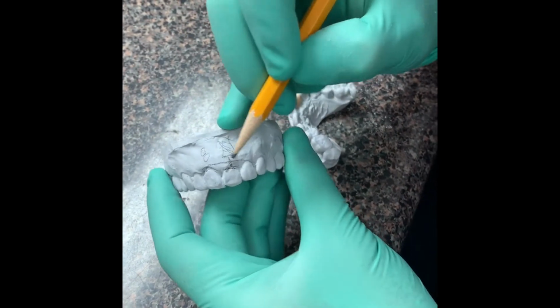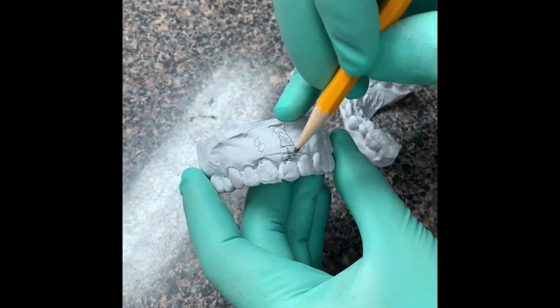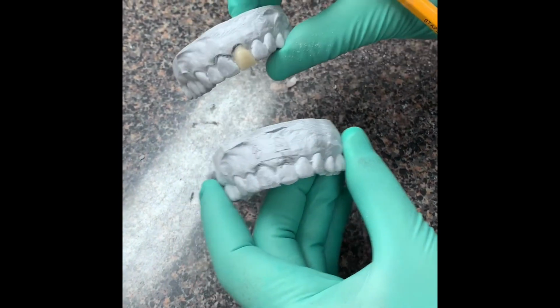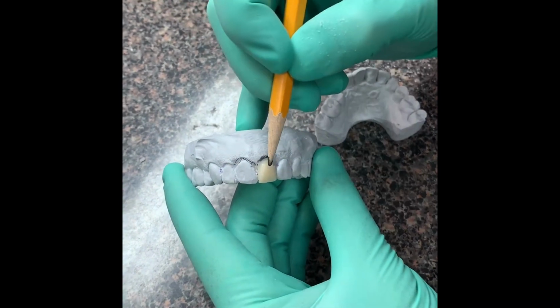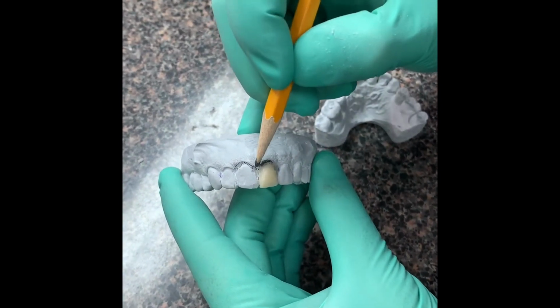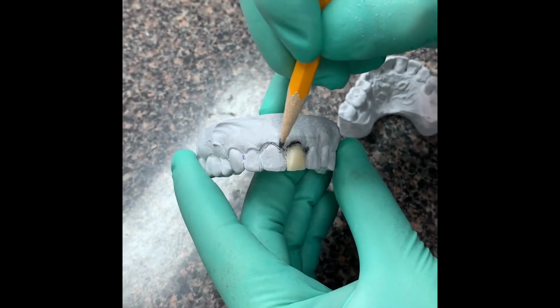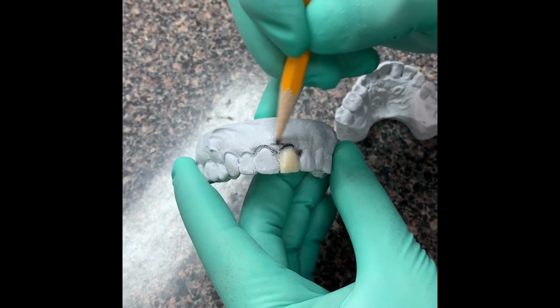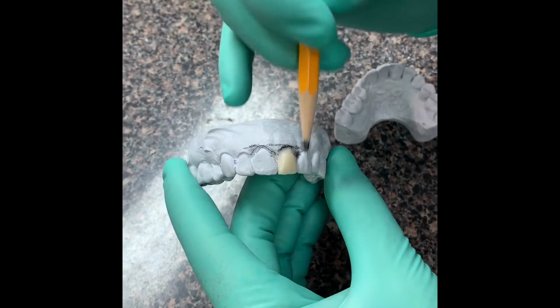So I'm going to go ahead and cut this down on another model, and then wax in magically, get ready, just a quick denture tooth, okay? So I cut the tooth off, and I went ahead and marked my gingival zenith here, as you can see, so that in general it lines up with the adjacent tooth next to it, okay? Of course, we're going to come back once everything's healed and everything's integrated.